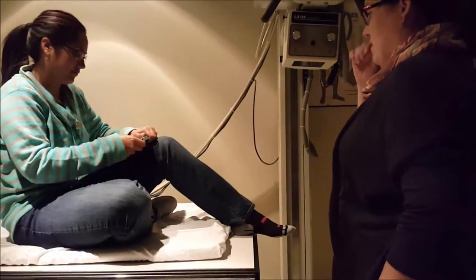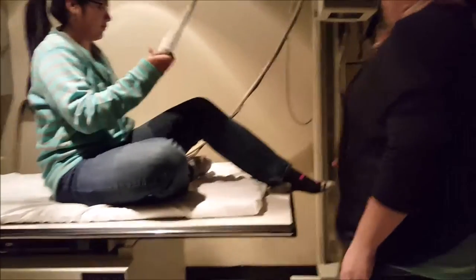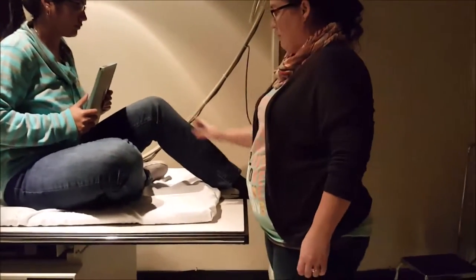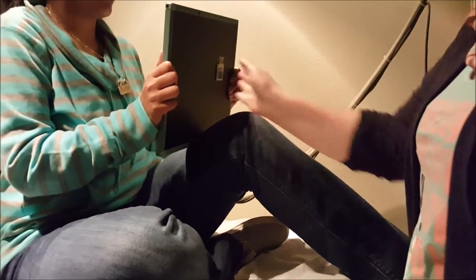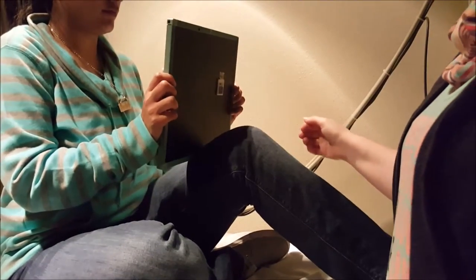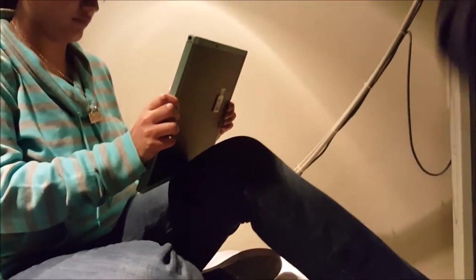For the sunrise view, or the Settegast method, we're going to have the patient seated with their knee flexed as much as they can. I'm going to have our patient help me with the cassette here. So we'll make sure, first and foremost, that it's centered. You can do it one of two ways. You can either have the patient have it relax down like this or like this. I prefer this way because of the OID. You get a little bit more magnification.